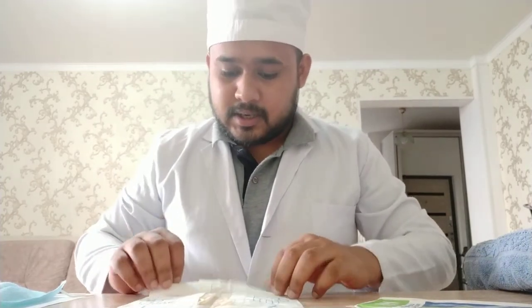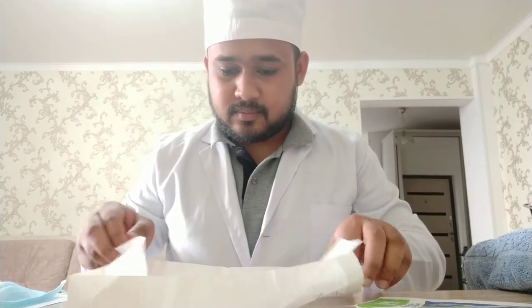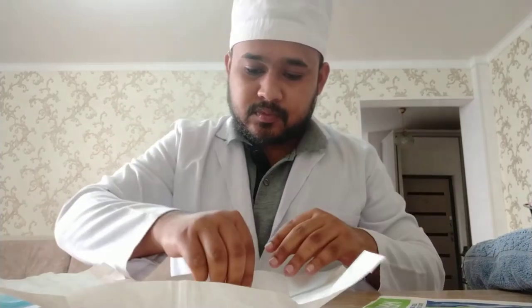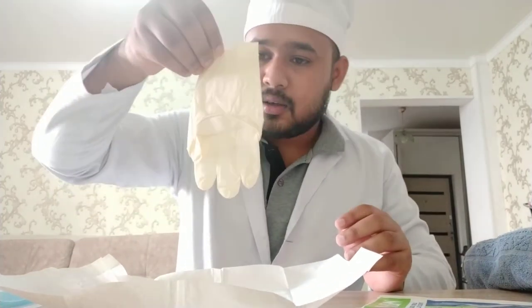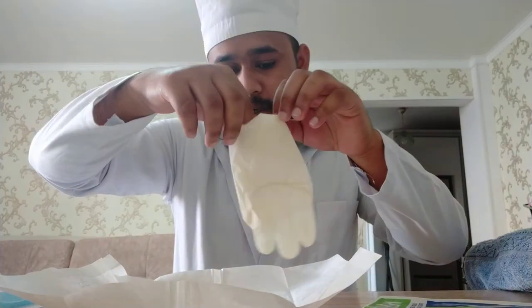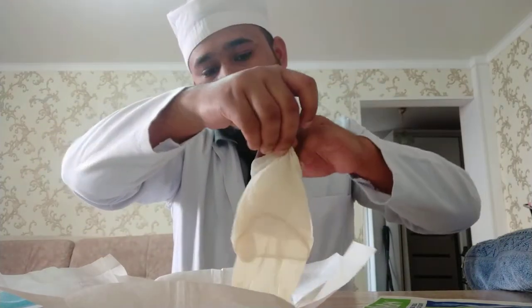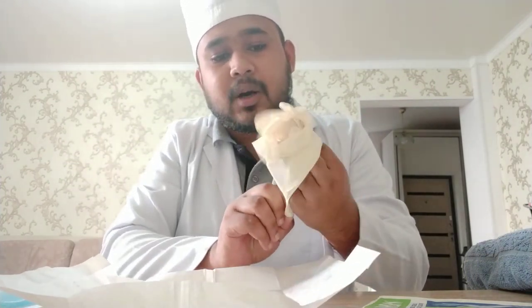So over here it's written left and right. First of all, for the left hand, just take the left gloves by the dominant hand. Don't touch the outer surface — that is the sterile part of the gloves.